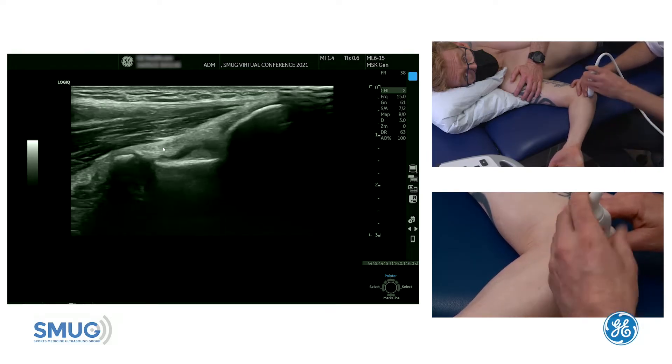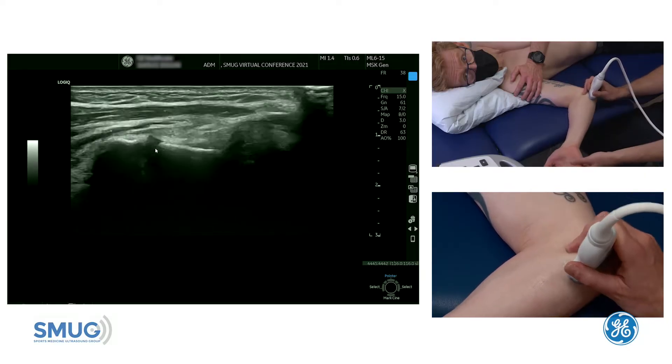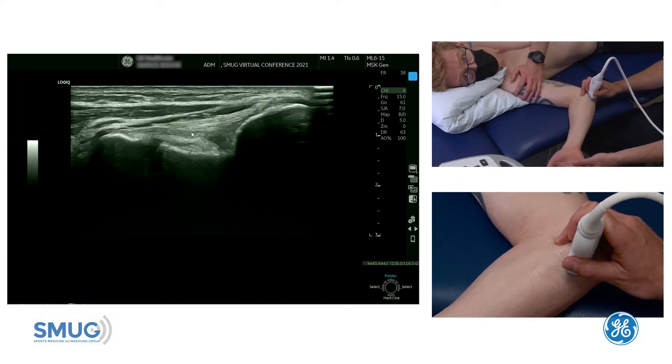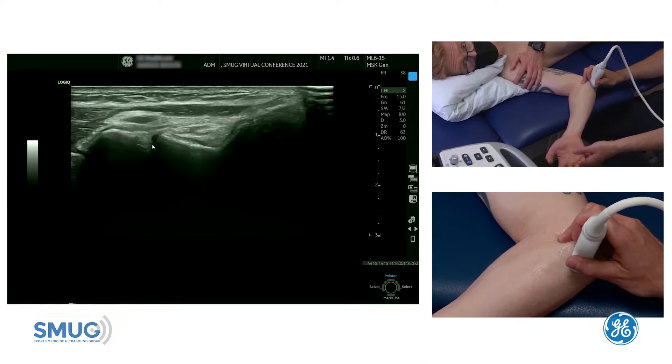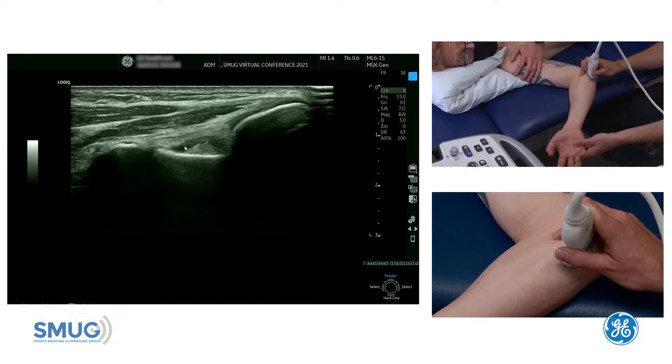If we then fishtail this end of the probe towards the little finger, keeping the other end of the probe on the epicondyle, we can actually see the ulnar collateral ligament just there. We try and line those fibers up — that's the ulnar collateral ligament — and you can see the joint underneath.